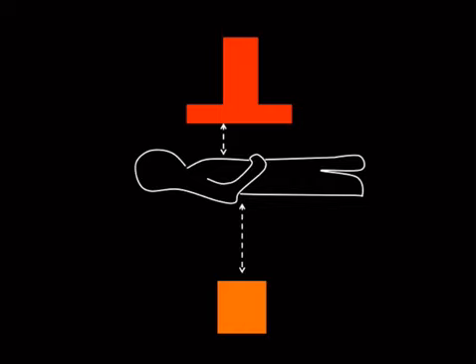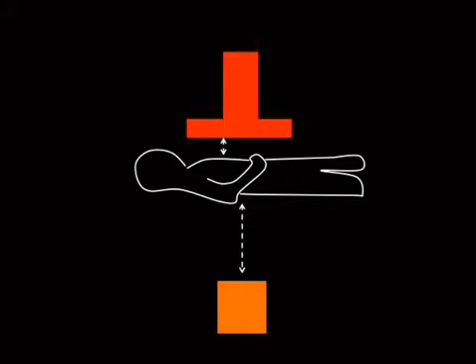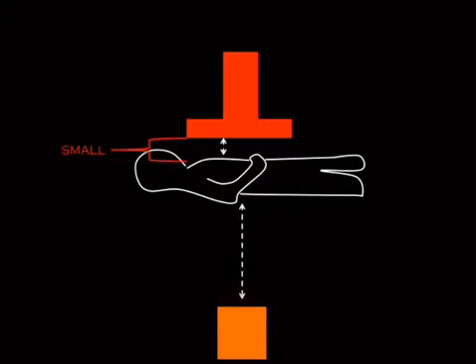and reducing dose? You just think back to what your fluorostations usually look like, assuming you've got a conventional fluorostation where the source is under the table, like that. So what you want to do is decrease this distance here. You try to bring that thing down right on top of the patient if you can. You want that small. And you want to increase the distance between the source and the patient.